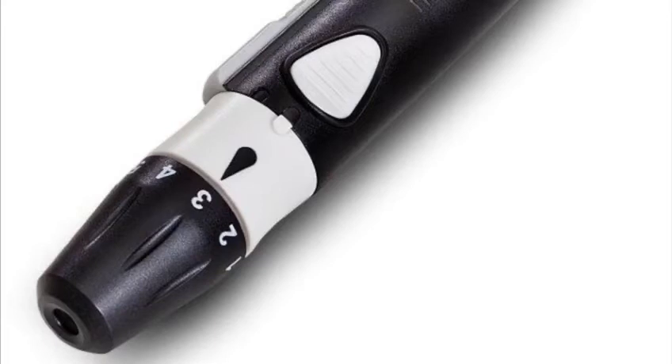On the top of the lancing device is a set of numbers from 1 to 5. This determines the depth of the lancet and you can twist it backwards and forwards to allow you the right setting in order to get the correct amount of blood to apply to the strip.